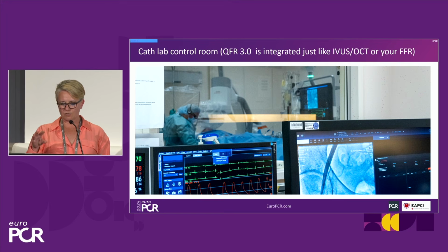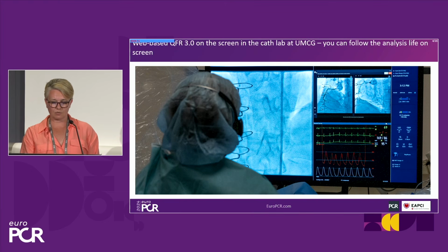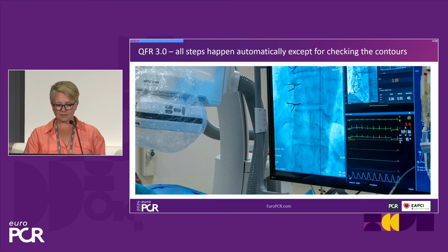And then you actually see the images also on the big screen in the cath lab, as you can see here in the picture. And you can usually communicate with your analyst as well. Most of this is really automatic, so you only have to give them advice about correcting the contours. You can follow the analysis live on screen. All steps indeed happen automatically.